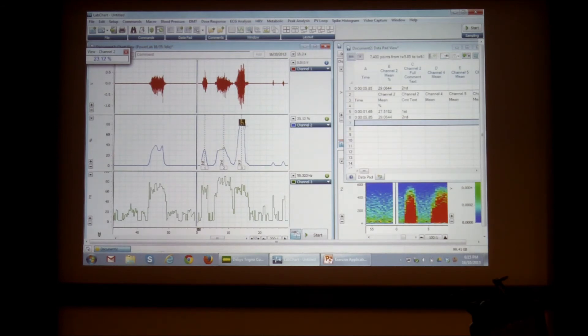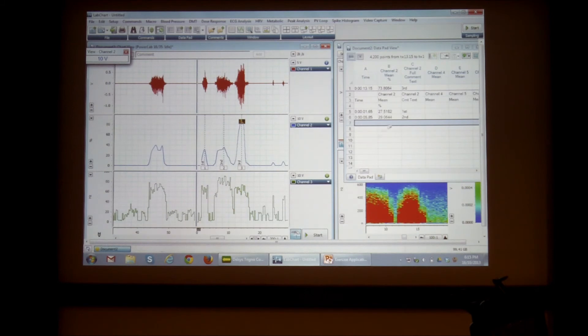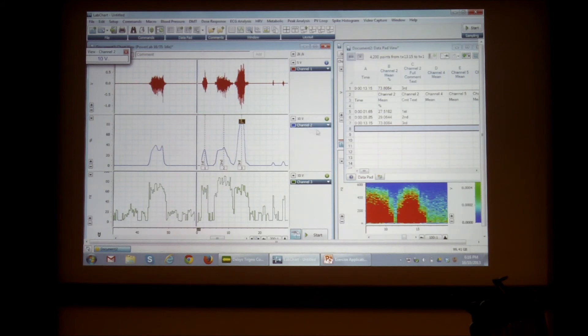And here I'm going to calculate the mean for the top here. And add.